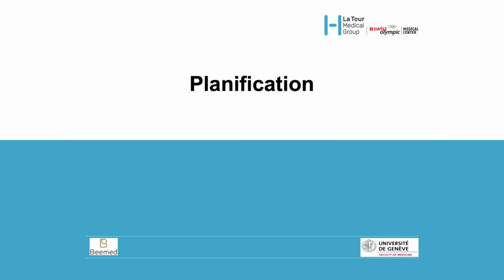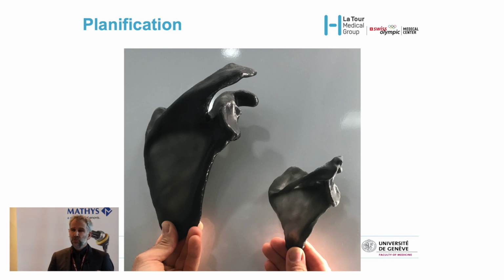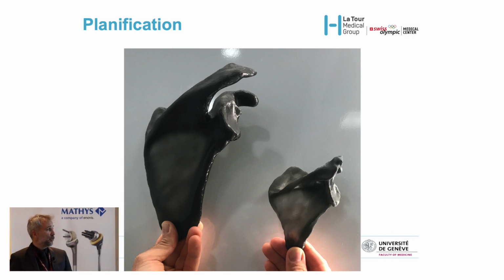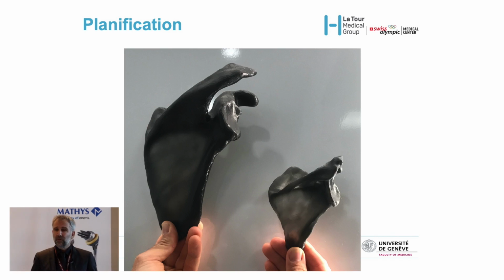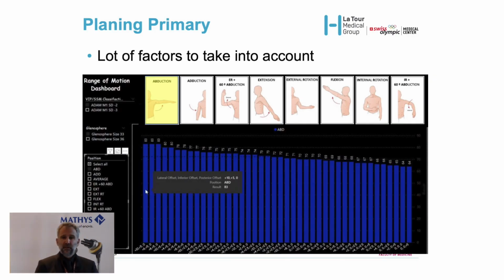Let's talk some minutes about planning. We know that planning is essential. Why? Because these are two scapulae of patients living on Earth today, and what is right for one patient is probably not right for this one. So we took 10,000 of these scapulae, and with a mathematical regression, we transformed them into 7 models. And then you can implant in these 7 models different prosthetic configurations: lateralization of the glenoid, distalization, size of the glenosphere, and so on.